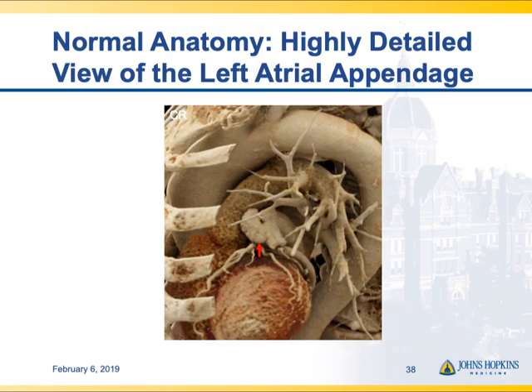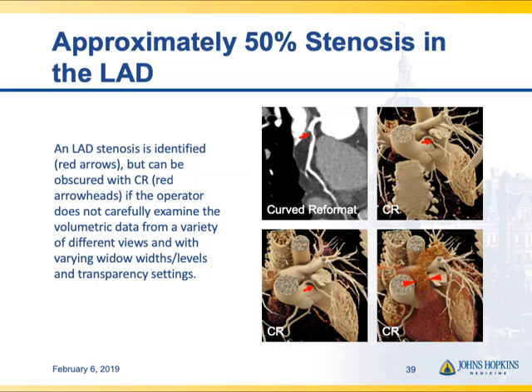Here's an example of normal anatomy — the left atrial appendage — just to show the remarkable level of detail you can achieve with good presets and window width and level settings with cinematic rendering. Here's an example of a stenosis in the left anterior descending coronary artery.